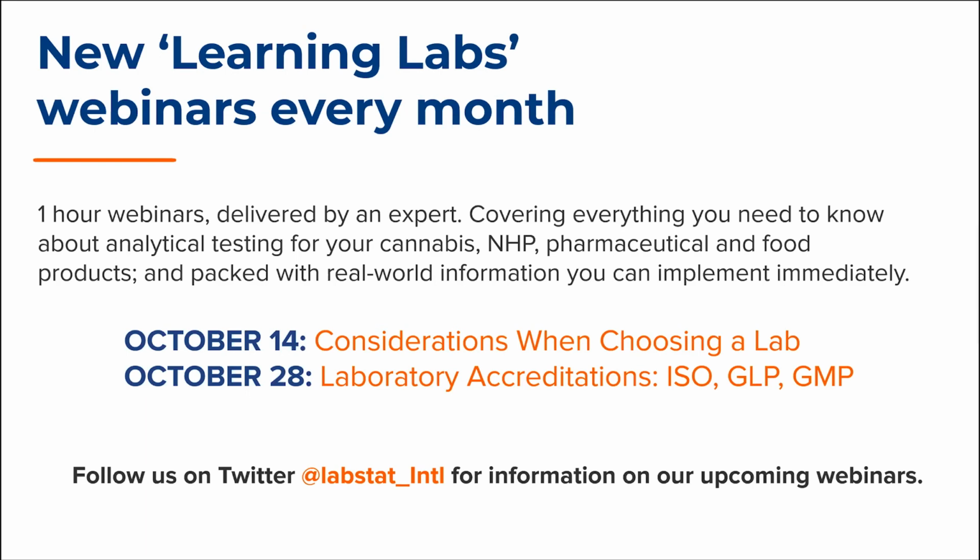That really boils down to our sample prep. Then what we would do is verify that our sample prep is delivering a sample that is consistent with what we validated our method for. We would do that by conducting accuracy and specificity experiments using that sample prep for that particular matrix.